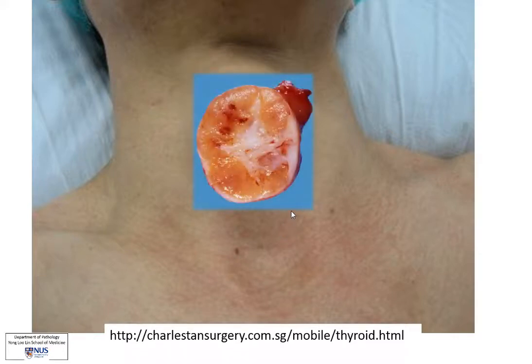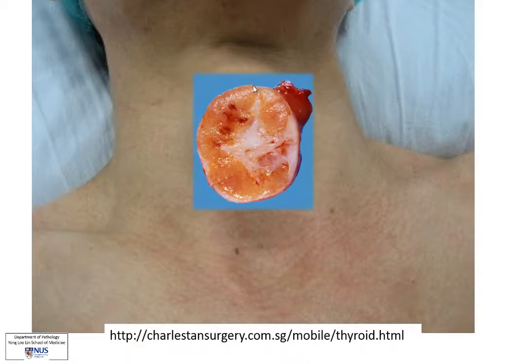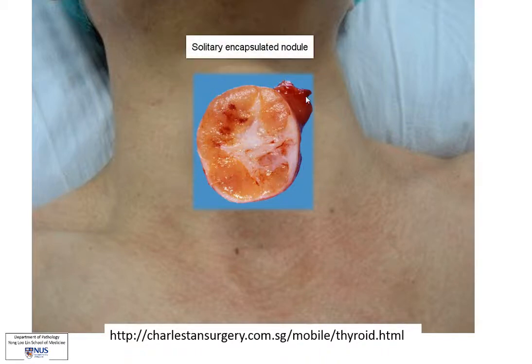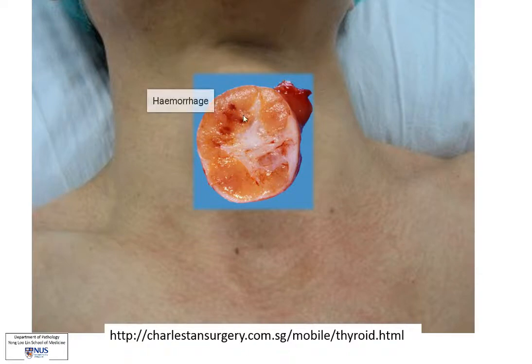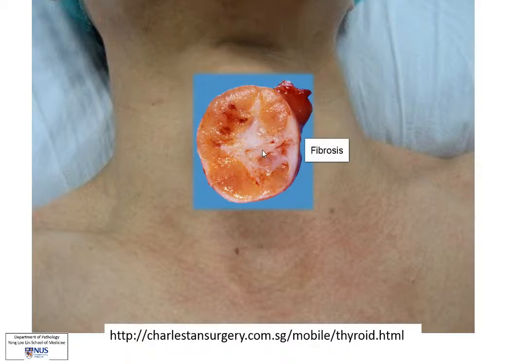This nodule is taken out, and when we look at the specimen received in the pathology lab, we are immediately able to see that this is a very well circumscribed, encapsulated, rounded nodule, and this is the rest of the thyroid. The nodule has a sort of orange-tan cut surface. There are some focal areas of hemorrhage, and these whitish areas probably represent areas of fibrosis or reactive changes.